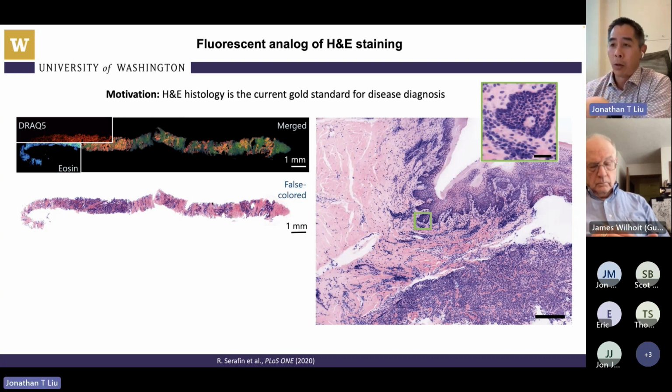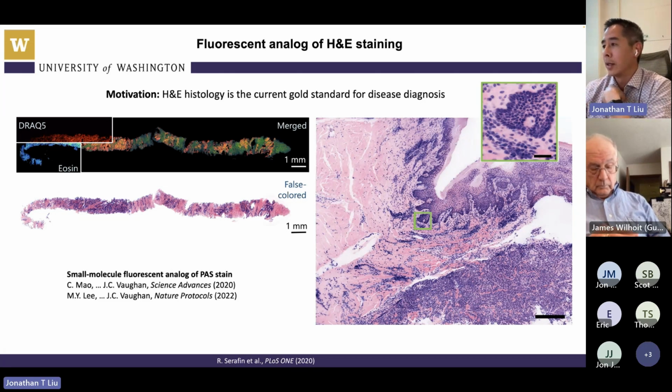Our cameras, however, are grayscale cameras. When we do fluorescence imaging, we use a black and white camera to collect the light. We have filters to filter out the different wavelengths, but the camera is monochrome. So to create these images, we false color them in software. And so we can do that using a simple Beer-Lambert law absorption physics-based model where we're modeling the absorption of light through these dyes, and we can color the tissues to look like their standard of care H&E.